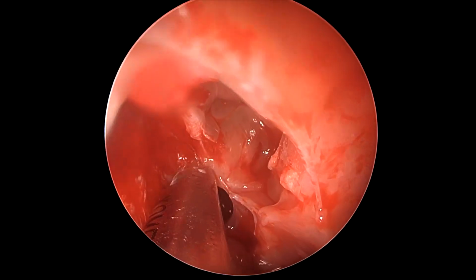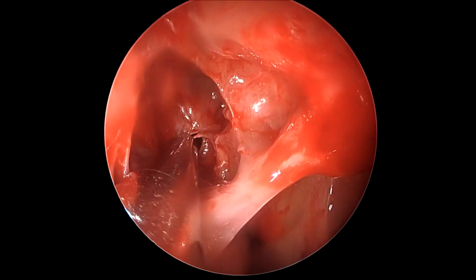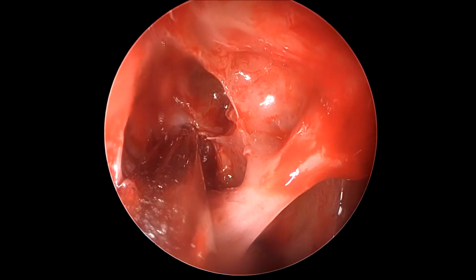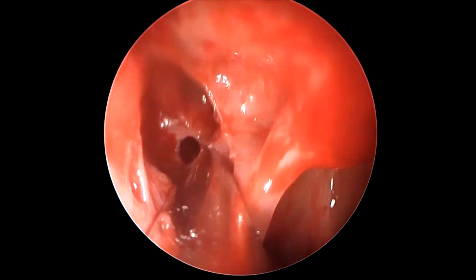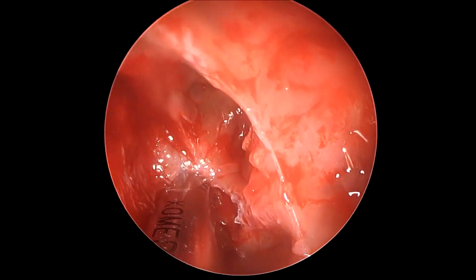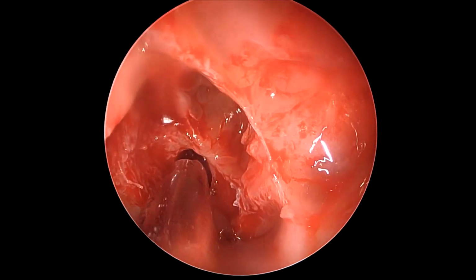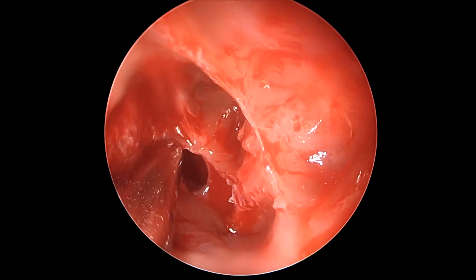So any soft tissue can be managed very well by the shaver blade, whereas any bone must normally be removed using either bone punches or straight mushroom forceps to create a wide sphenoid opening. Because in revision surgeries, normally one would not like to take a chance, and we want to create as clear and straightforward a corridor for generous irrigation in the post-operative period by the patient to be able to achieve adequate outcomes.